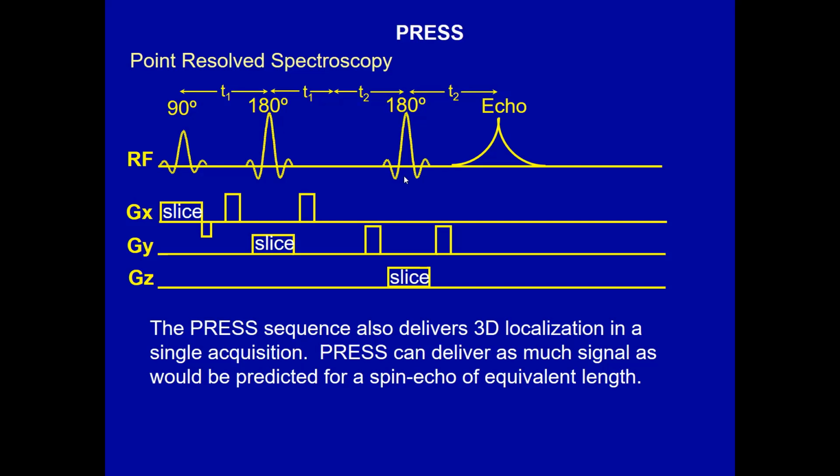If you are in a more homogeneous location and you can tolerate a little bit longer echo time for whatever you need to acquire, PRESS is a great choice.